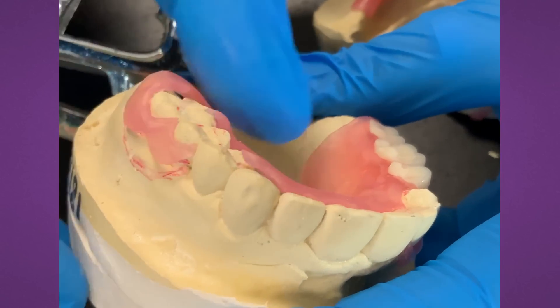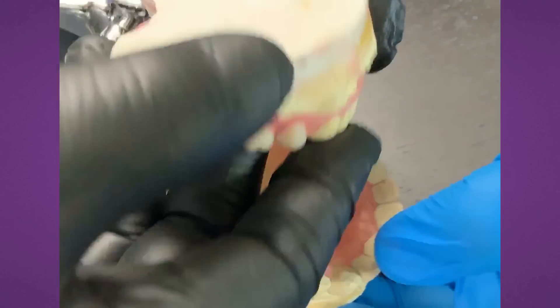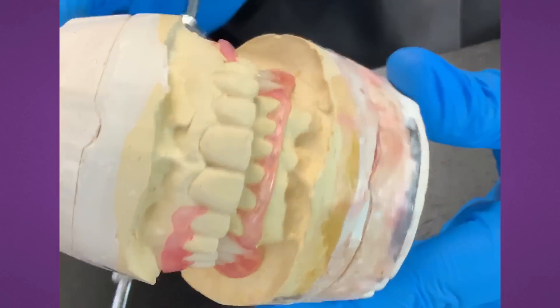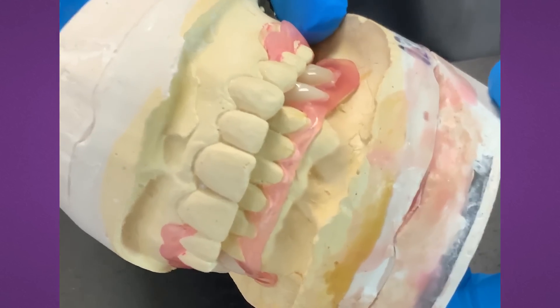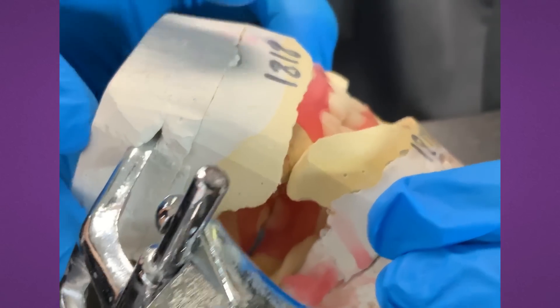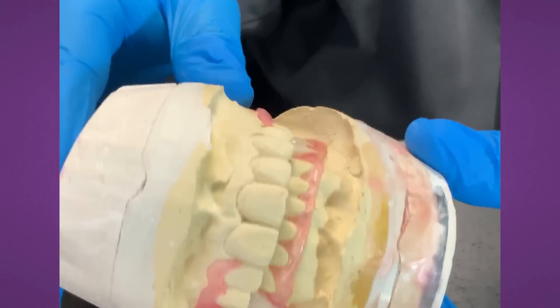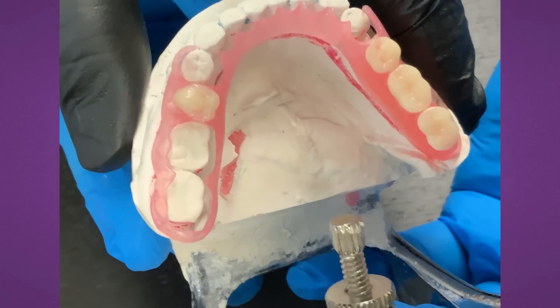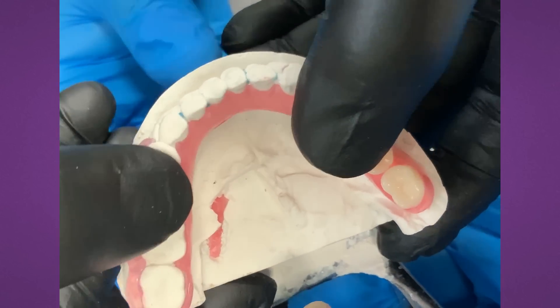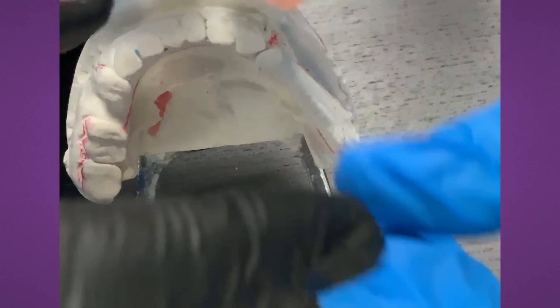That's not going to catch the patient's cheek back here either. Good news is we can repair and reline on the laboratory side. We can go right into the rest preps that doctors already have cut from the partials. Here is a live case, top and bottom — you can see the occlusion contact. There's no interference in materials back here, because with that slimmer design you don't have to cover all the way back for retention because it has really great gasket-style clasping. You can leave areas exposed so there's more tissue contact and teeth contact. It's really flexible — just like that.